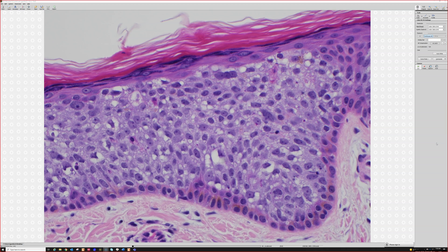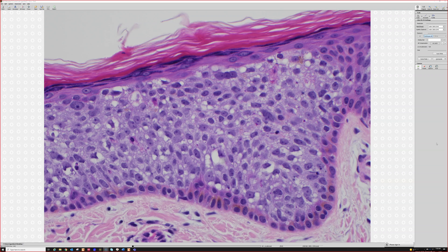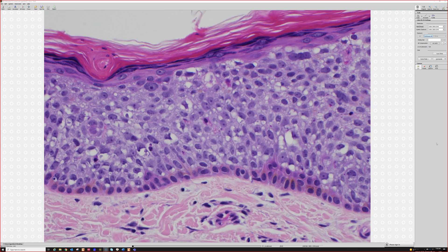...sometimes doing Ki-67 or MIB1 and p53 can be helpful — it'll show a lot of expression. I don't do that very often, but occasionally I've had cases with a large pigmented patch on the face where I'm deciding between a big seborrheic keratosis or squamous cell carcinoma in situ, which would significantly change management. In those cases, sometimes I've done that staining.